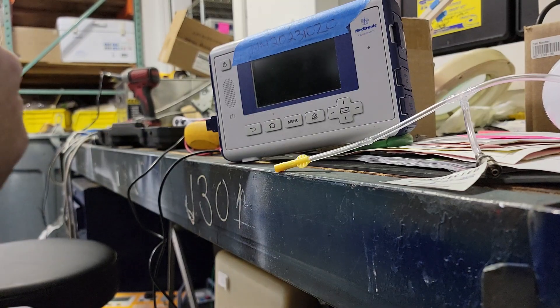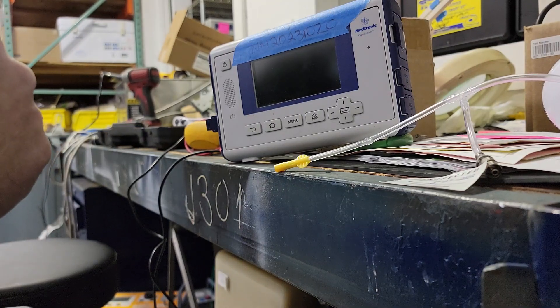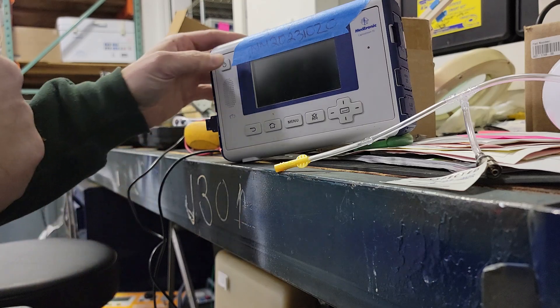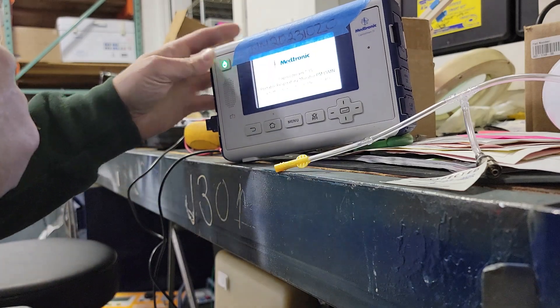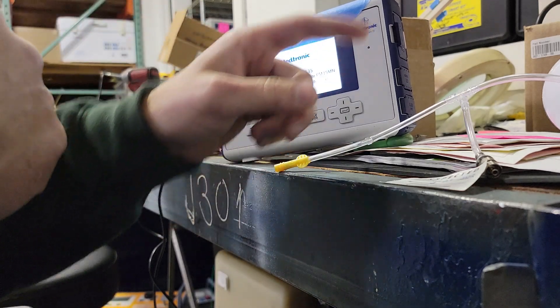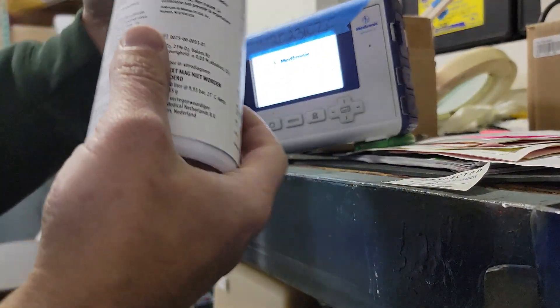This is the CO2 calibration for a Medtronic Capnestream 35. Let's turn this on.